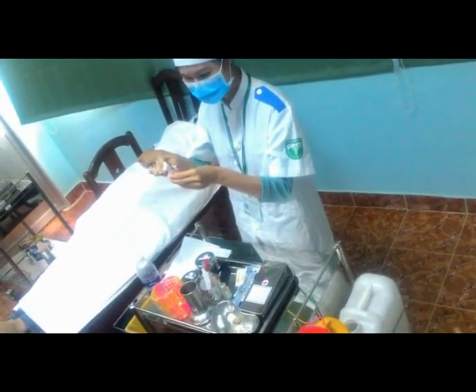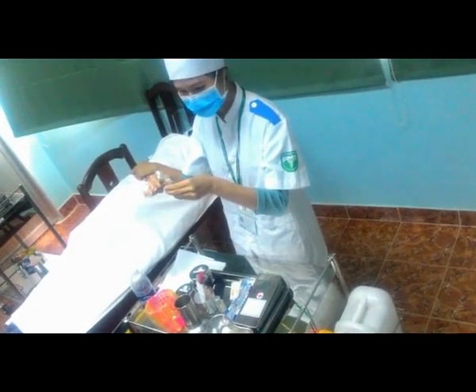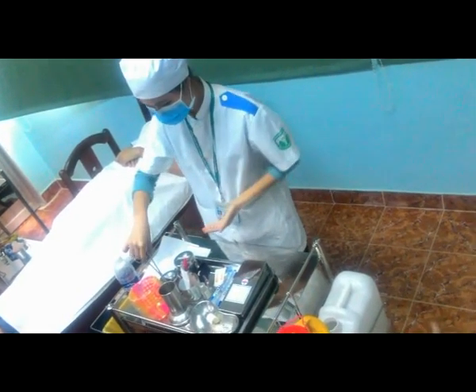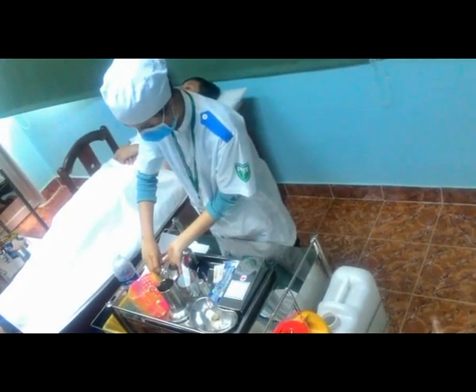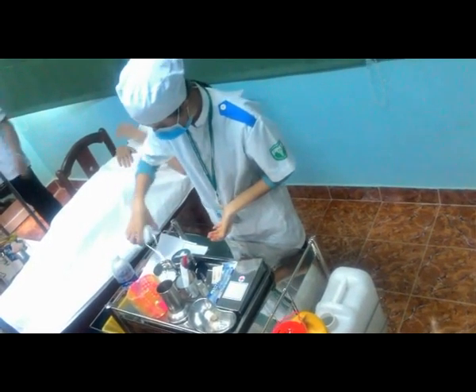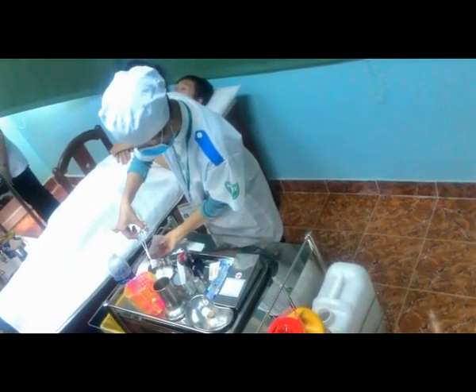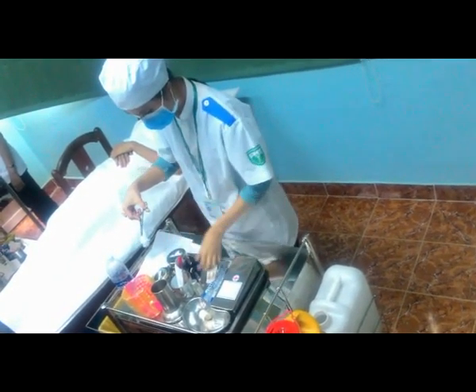Dùng gòn cồn iốt 1 phần ngàn sát khuẩn đầu ống nước cất, rồi sát khuẩn đầu lọ thuốc.